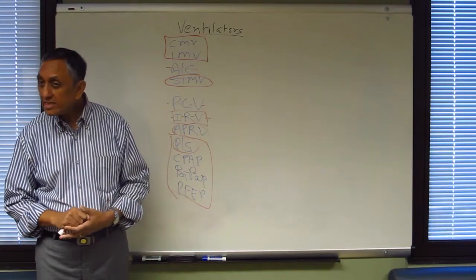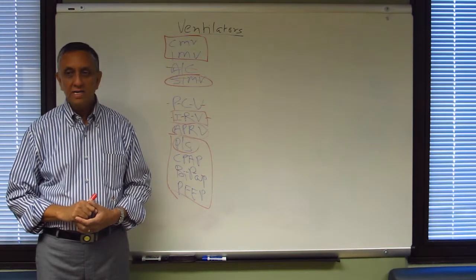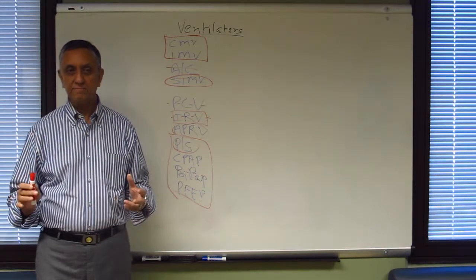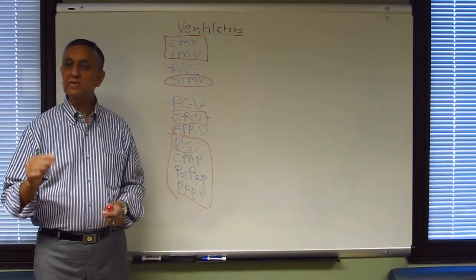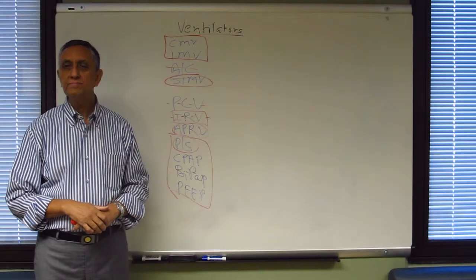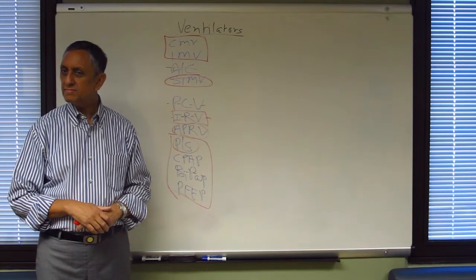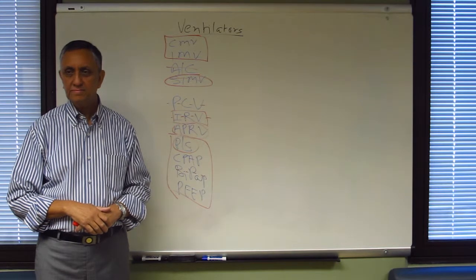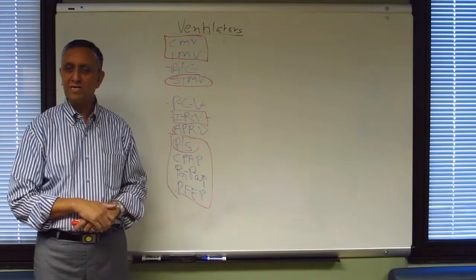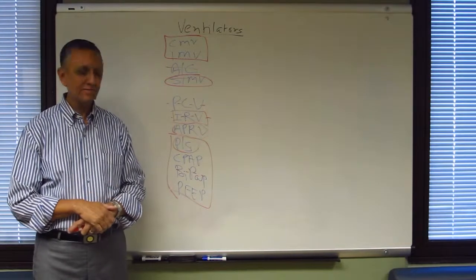But there's also an expiratory pressure. I don't understand. Sorry, can you say that again? Isn't there also an expiratory pressure in pressure support, unless you set it otherwise? The book description or definition is the amount of pressure given during inspiration. Okay, I guess I've just never seen it without a PEEP. Never seen pressure support without any positive pressure while expiring. It's always like 8/5. Let's finish all this, and then if you still don't understand, we'll talk, because I think you're going all over. It will all be clear by the time we finish.